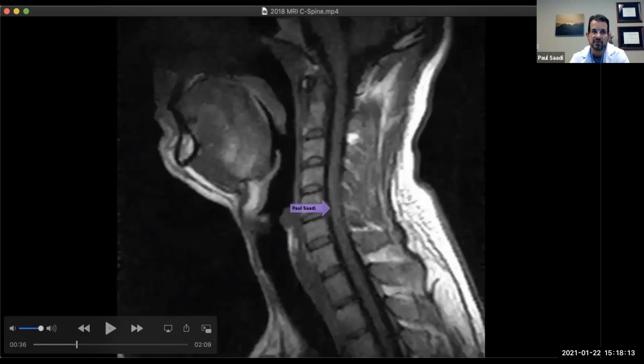Yeah, like I said, there are a number of different factors, but when we see someone who has essentially a completely normal spine, no signs of degeneration, and a large disc bulge like this, it is generally a sign of a single specific acute traumatic injury, which in his situation is a big enough level of pathology that it would be very hard to be symptom-free with this pathology going through regular life. Meaning he would have very likely sought medical treatment when this occurred, or had some significant symptoms.